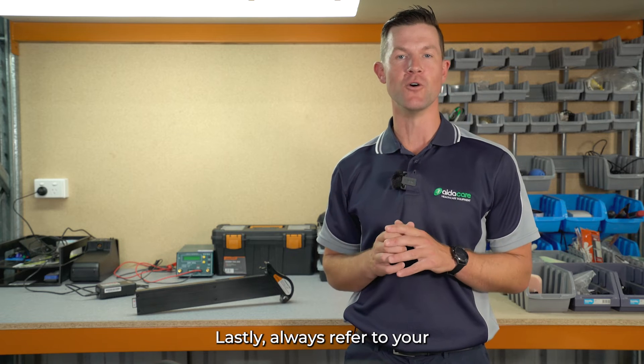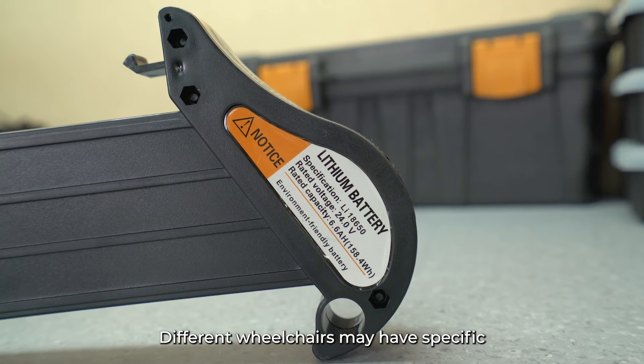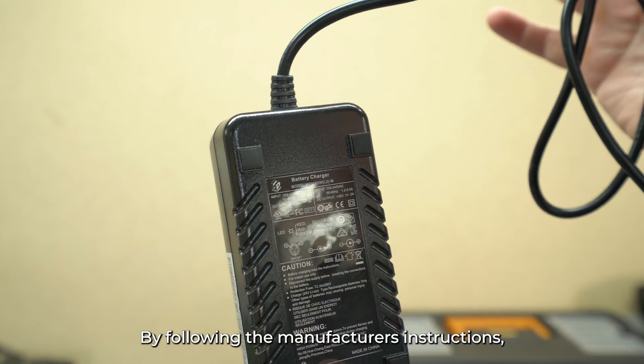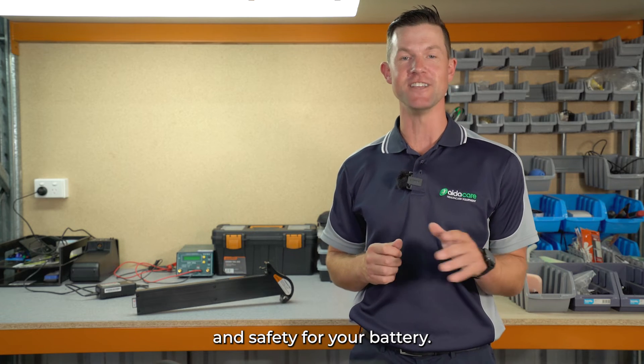Lastly, always refer to your power wheelchair's manufacturer instructions. Different wheelchairs may have specific battery requirements. By following the manufacturer's instructions, you'll ensure optimal performance and safety for your battery.